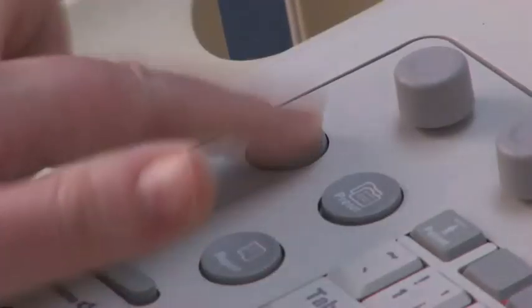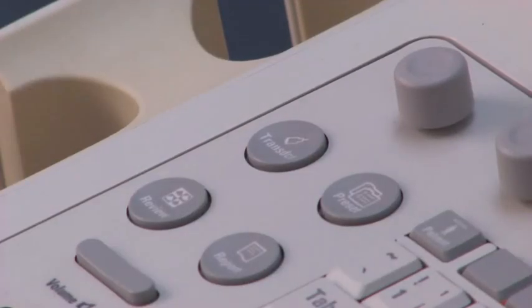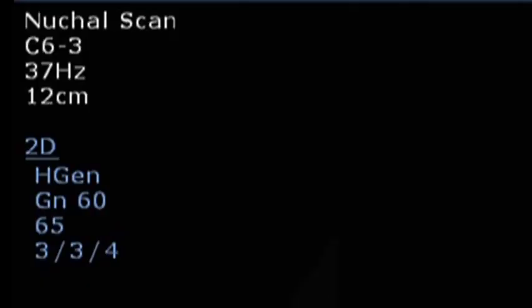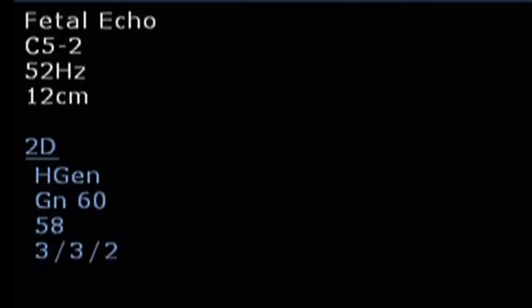Select the appropriate transducer. Select the standard preset for the type of obstetric examination.